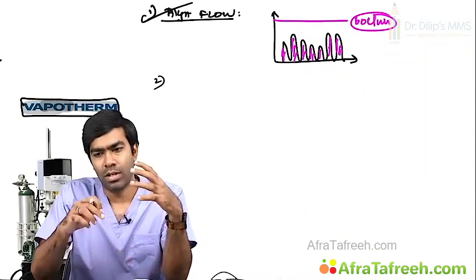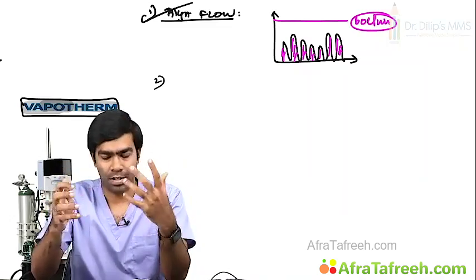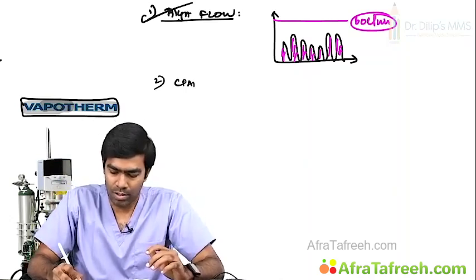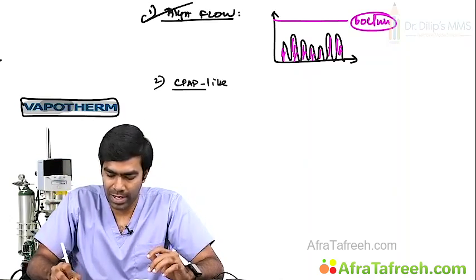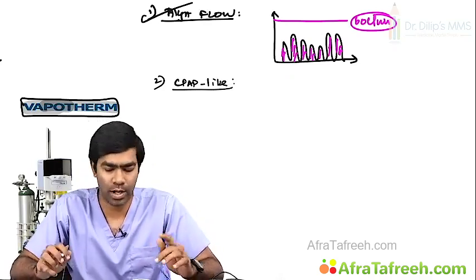Second, a big advantage is that they create a CPAP-like effect. So you have to be cautious. I am telling only CPAP-like effect. I am not telling a CPAP effect. That's continuous positive airway pressure. How can they do that?